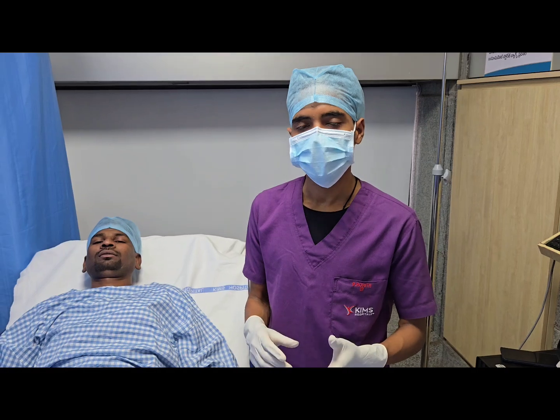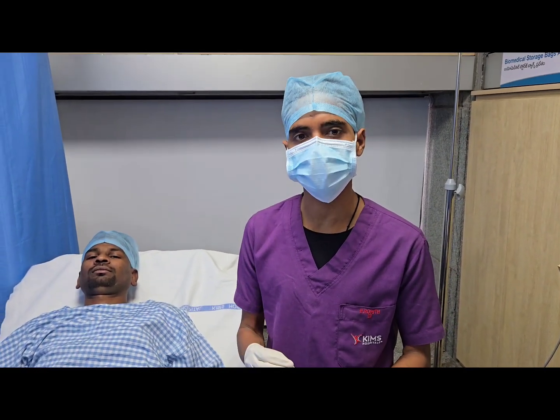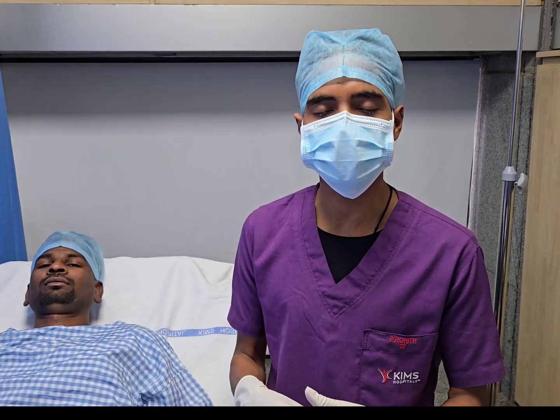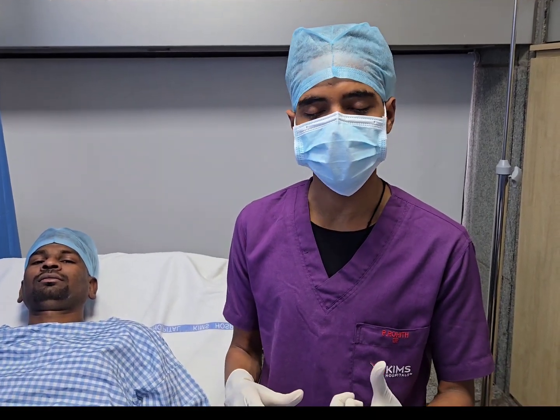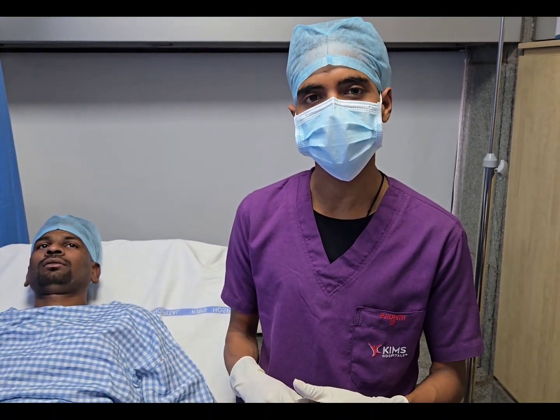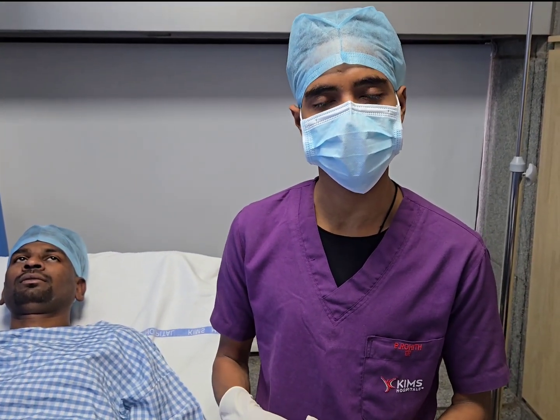Lastly, while keeping the oropharyngeal airway, there are some complications. What are the complications? There may be oral trauma and gag reflex, and ineffective ventilation due to an inappropriate OPA size. So this is the information regarding the oropharyngeal airway.